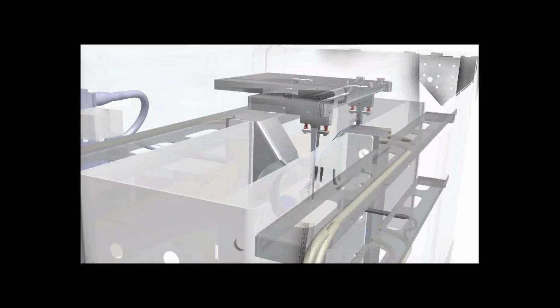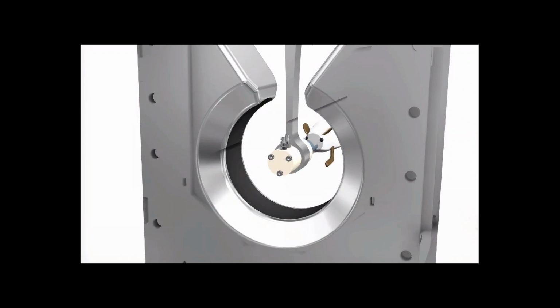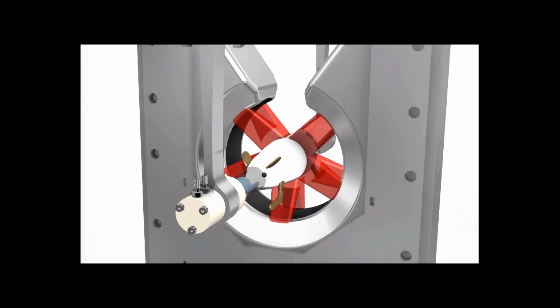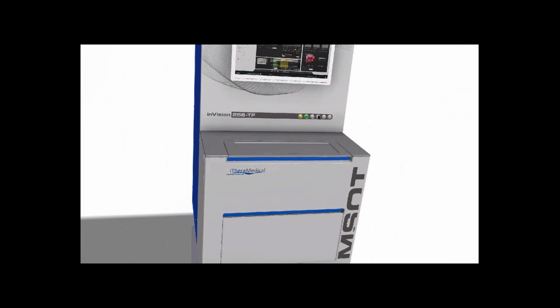This holder is then placed inside of the tank, shown here, and now you can see the ultrasound transducer, in this case a 270-degree array, inside of which are the ultrasound detectors, and this device also provides the illumination. So as you can see in the next part of this video, the animal is then translated through the imaging plane where it is illuminated, shown here with the red bars, and then we detect the outgoing ultrasound signals. We can then do sequential 2-dimensional imaging, and after the experiment, we can render a 3-dimensional volume.